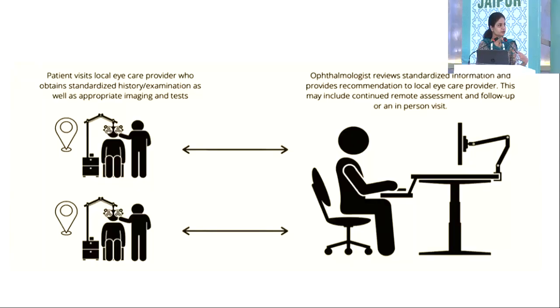So whenever a patient visits in the remote areas, the local healthcare provider will take the image and share it with the ophthalmologist. The ophthalmologist, after reviewing the images, will give his expert opinion to the local healthcare provider.